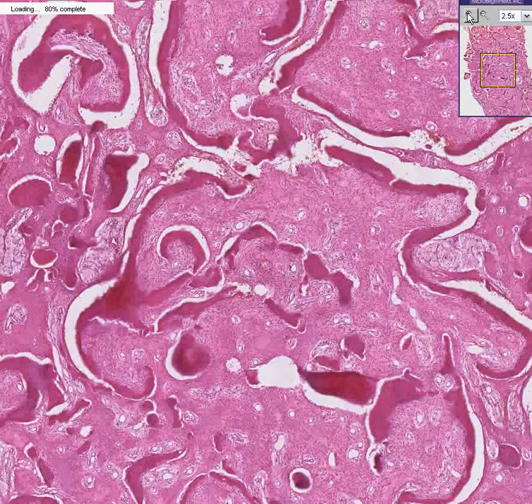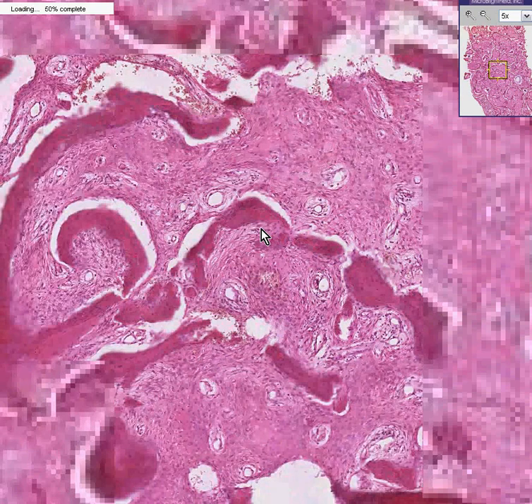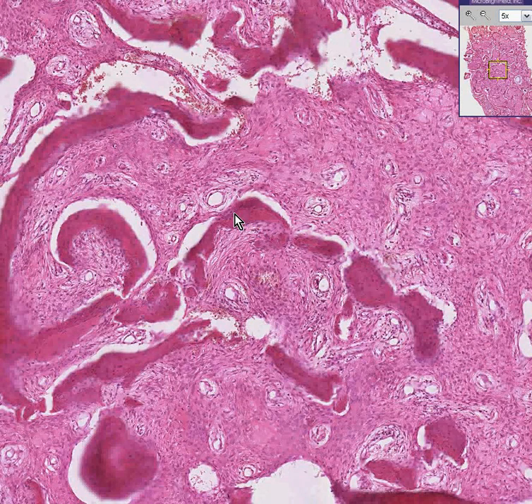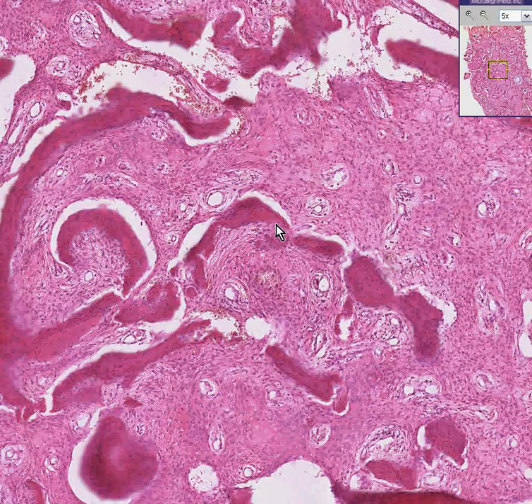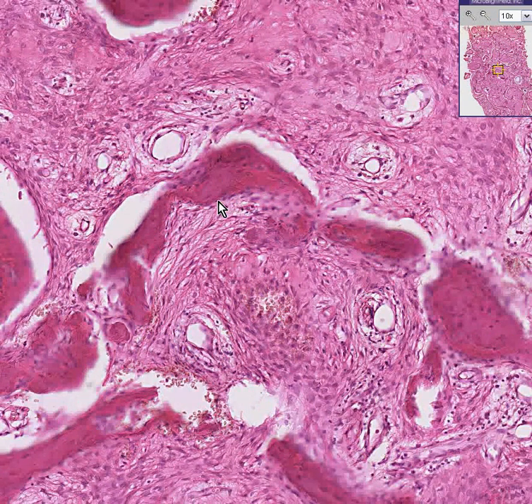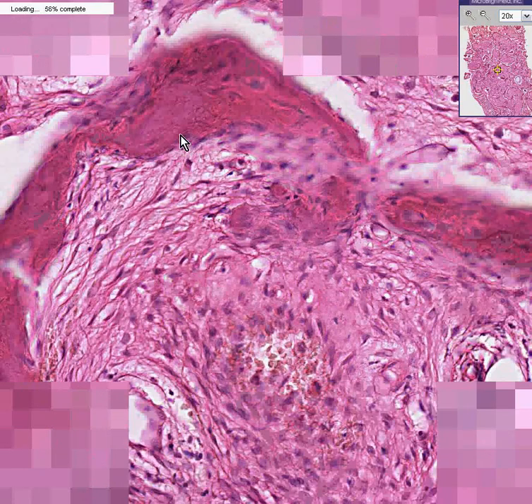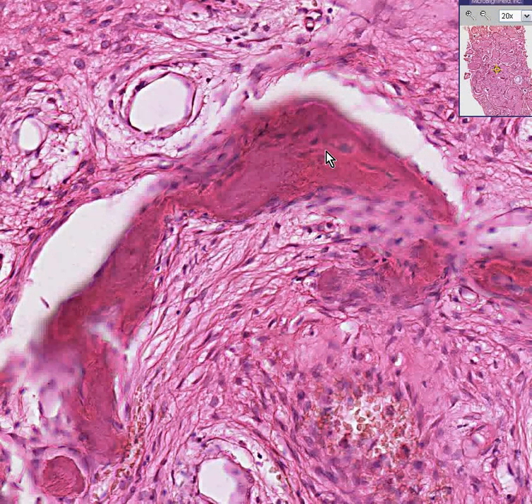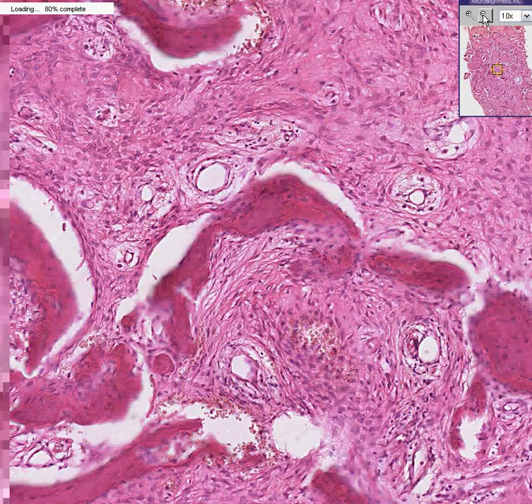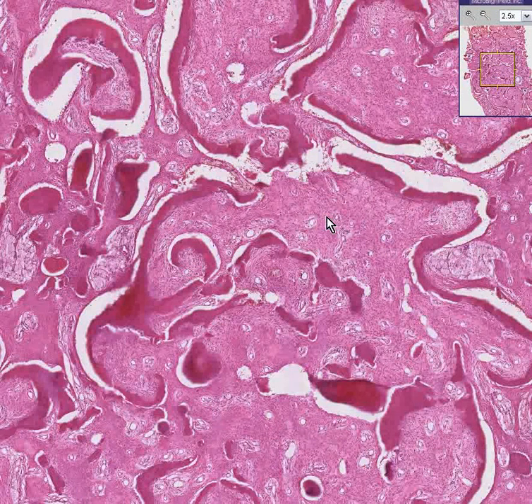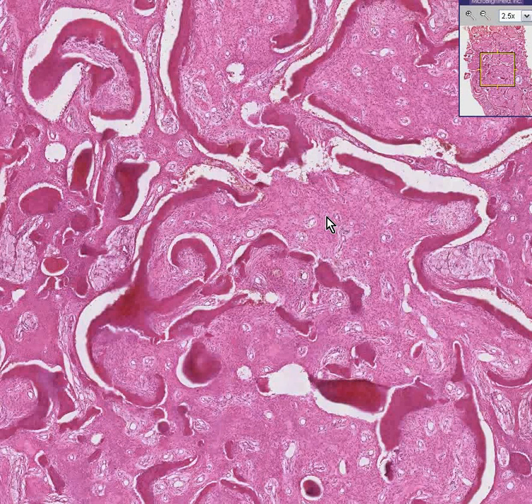Fibrous dysplasia is usually involving one bone most of the time, though it could be multiple. What you can recognize in this biopsy is that these darker, purpler areas are trabecular bone. You can see the spicules, they are peripherally rimmed by osteoblasts, and inhabited by osteocytes. But in contrast to most bone, this marrow is completely overgrown by a proliferating fibrous tissue.